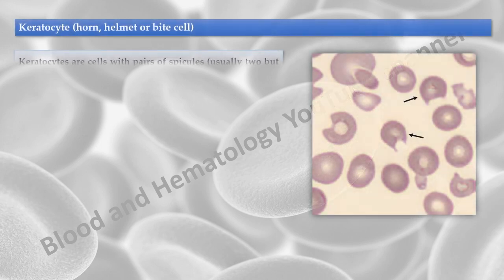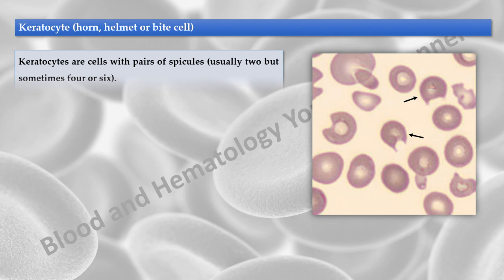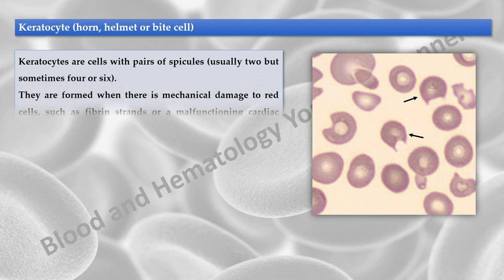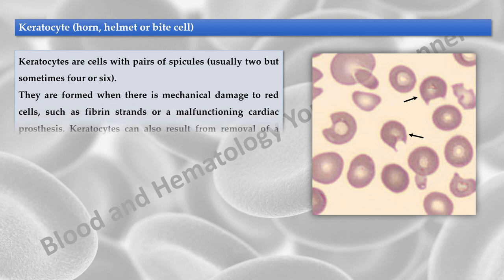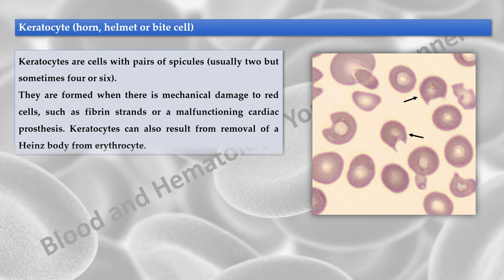Keratocytes are erythrocytes with pairs of spicules, usually 2 but sometimes 4 or 6. They are formed when there is mechanical damage to red cells, such as fibrin strands or a malfunctioning cardiac prosthesis. Keratocytes can also result from removal of a Heinz body from an erythrocyte.